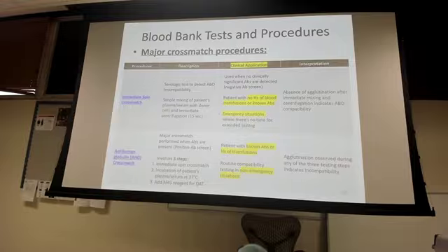We're doing an immediate centrifugation, 15 seconds. We're checking to see if there's agglutination. If not, good to go, right? And we'll issue the blood real quick. So that's really only a time when you see trauma, things coming into the ED. Oh, and also this is with somebody that has no history of blood transfusions and has no known antibodies. We will do an immediate spin cross-match and get you that blood as fast as possible.